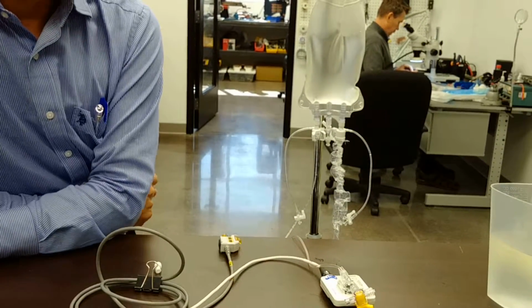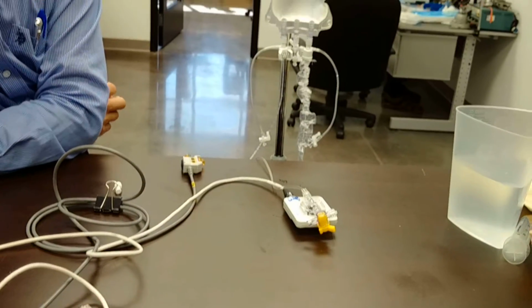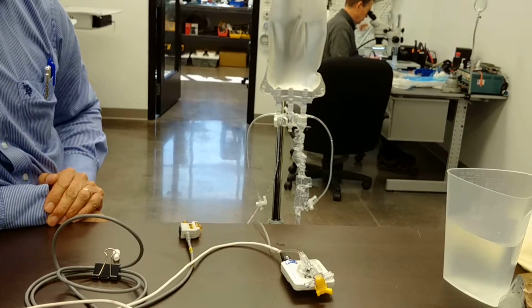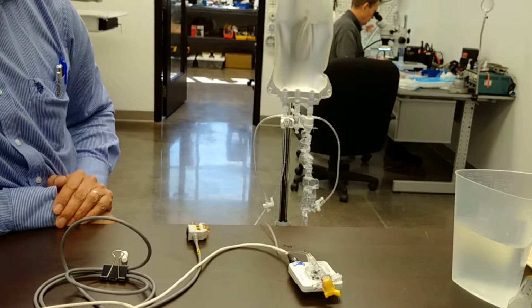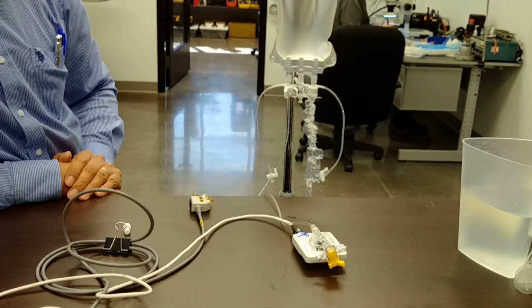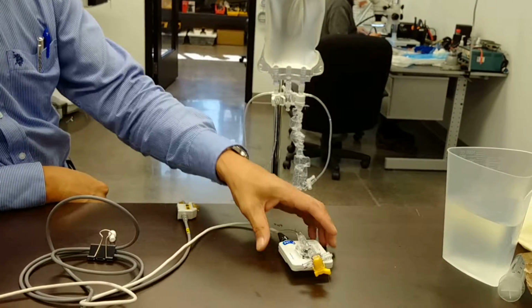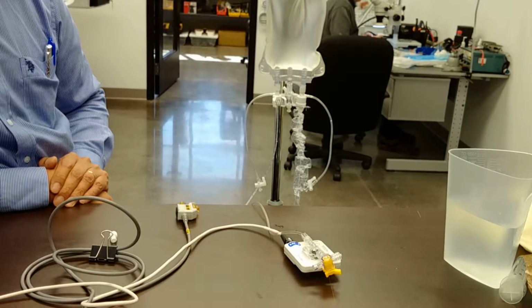And it's probably our suggestion that we include the water transducer as part of an air charge measurement. Again, we're only using one catheter in the patient, we're not using two. We're really getting the benefits of both water and air to get the kind of baselines that we expect, the kind of pressure behavior based on symphysis pubis, based on good urodynamic practices, with all the conveniences of the air system.